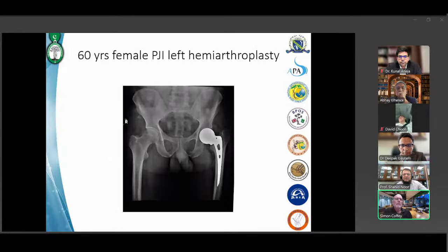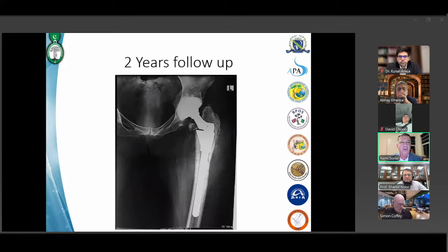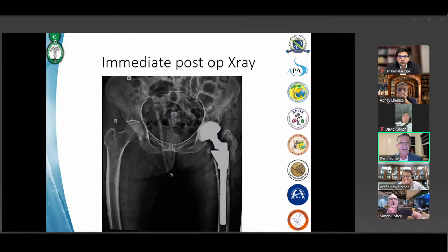So another patient with a question to expand on: in that large trochanteric fragment, what Kunal identified, the need to put a plate fixation, a hook plate. I would have done the same. So for the sake of explaining a little bit more your technique, because you achieved an excellent result without any fixation, any special tips on the technique of repairing that using fiber wire? Yeah.